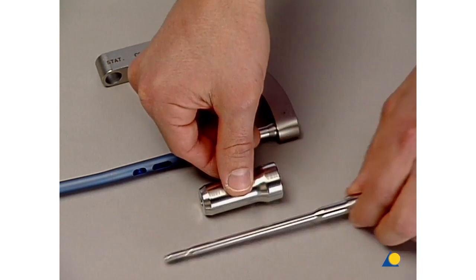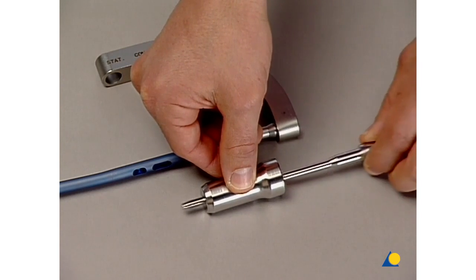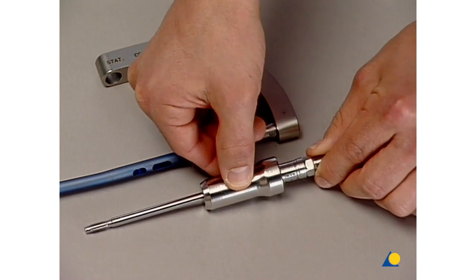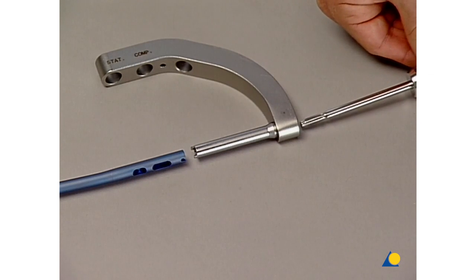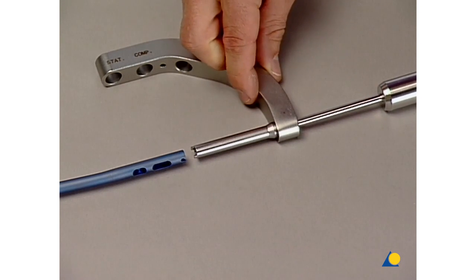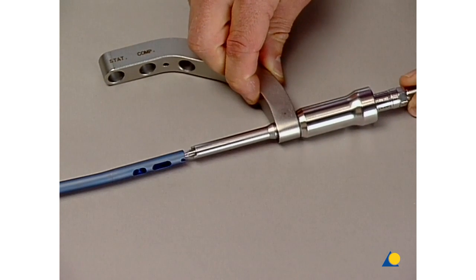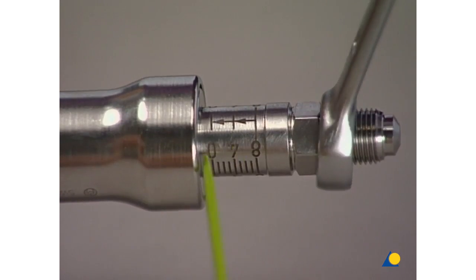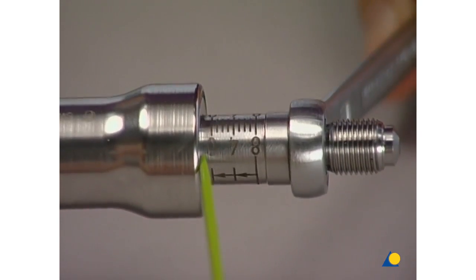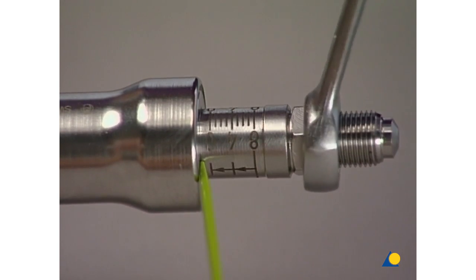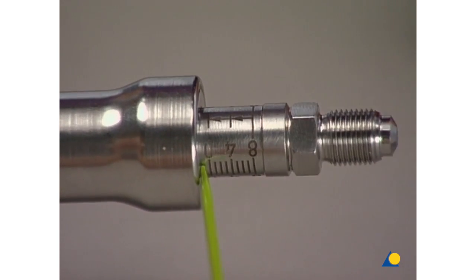Before inserting the UHN, the compression device has to be mounted onto the insertion handle, replacing the connecting screw used for standard nail insertion. The end of the compression device shows a scale indicating the number of millimeters of fracture gap that can be compressed by tightening the compression connecting screw.